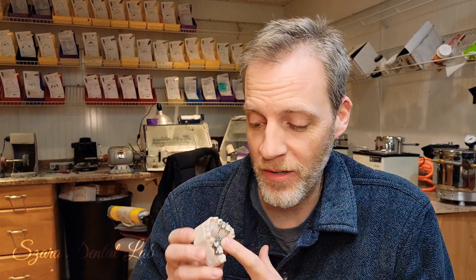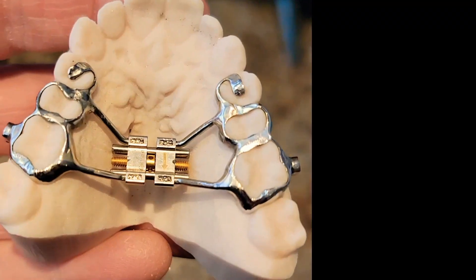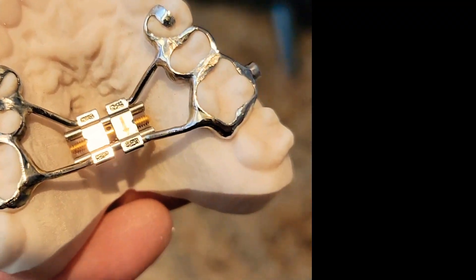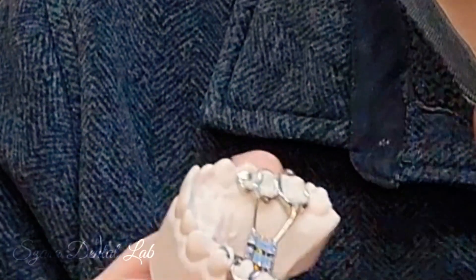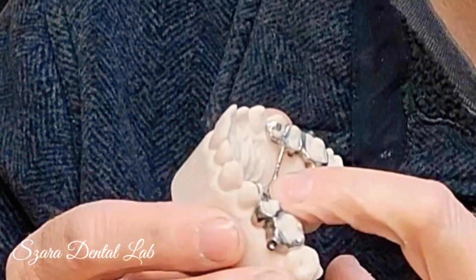Hi everybody, Steve Zara here from Zara Dental Lab. In this video I'm going to show you something pretty wild — I actually made my own metal-centered expander. That's right, I printed a model and designed the case and made it so I can try this expander on myself.